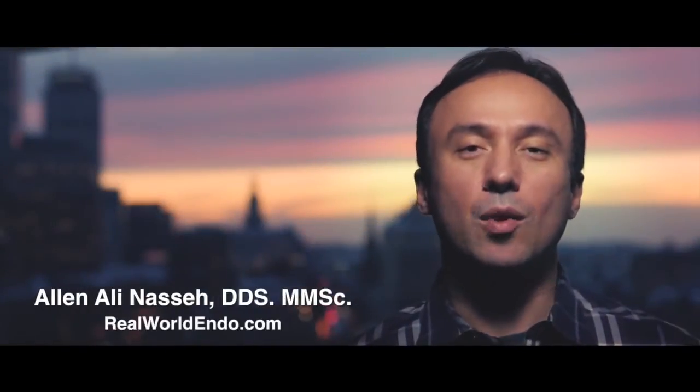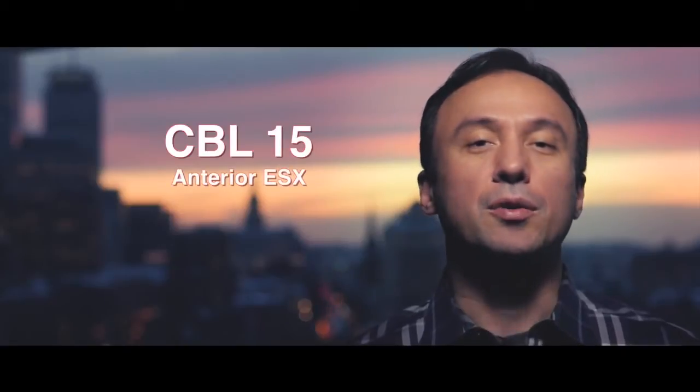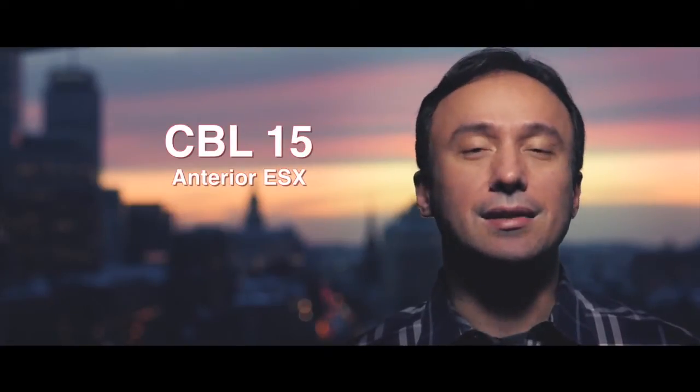Hello people, clinicians. This is Ali Nassay and welcome to another case-based learning module. This is CBL number 15. We're doing an anterior tooth using again the ESX instrumentation and obturation system.